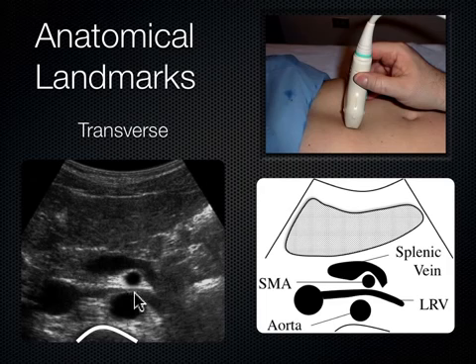So if we look between the aorta and the SMA, there's this blood vessel that gets nut-cracked between those two vessels and then dumps into the IVC. So what blood vessel do you think gets nut-cracked between the aorta and the SMA that then drains its blood into the IVC? Left renal vein. Very good. LRV. Excellent. You guys are getting good. You guys are good at this.